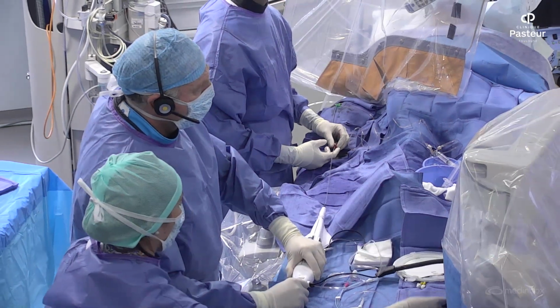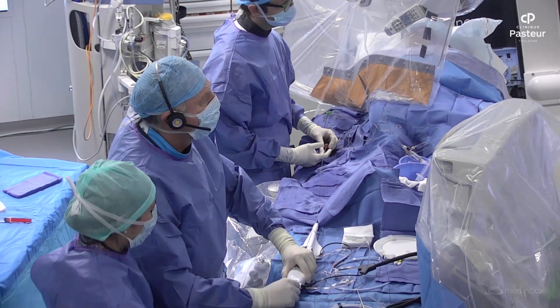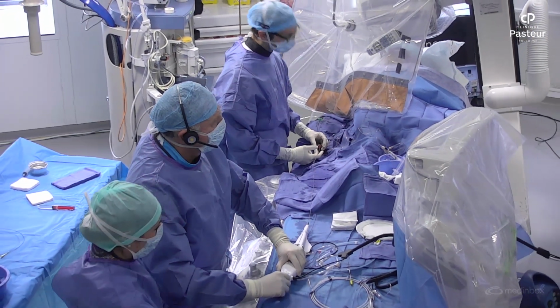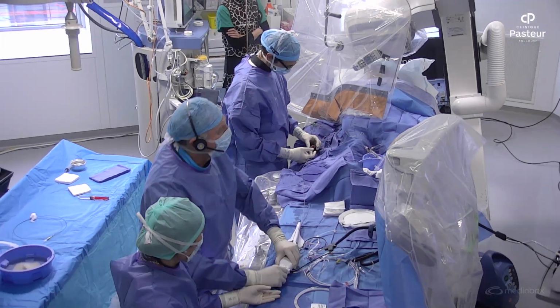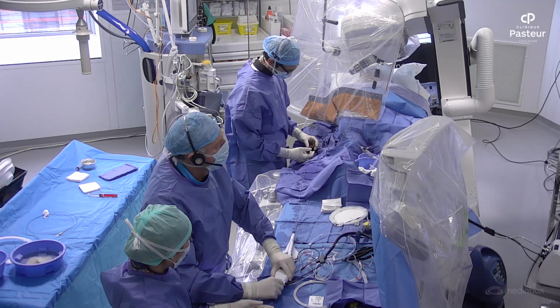Yes. Another issue that might be, let's say, taken for granted, but when you do a bifurcation with rotablation, you never use 2 wires, okay? Only one wire on the vessel you rotate, and then you put the second wire. I think that after they remove the rotaburr, they will put the second wire to protect the diagonal before the balloon dilatation, but never rotate on 2 wires.